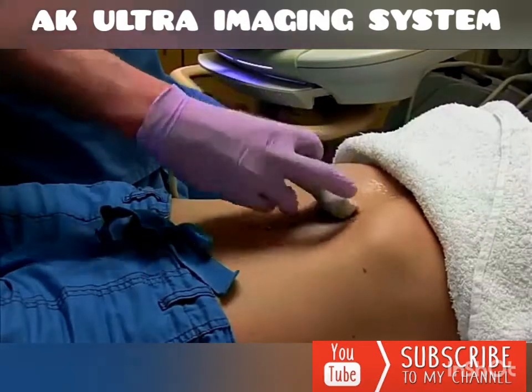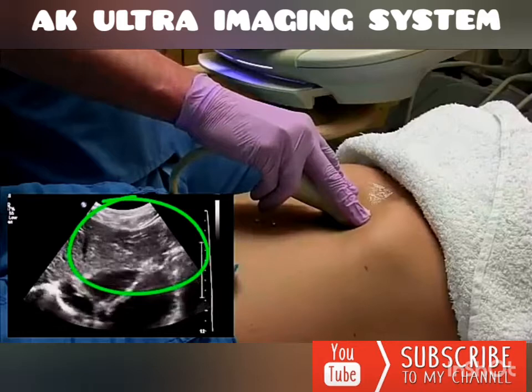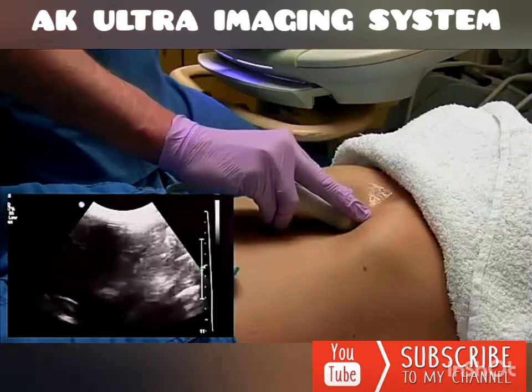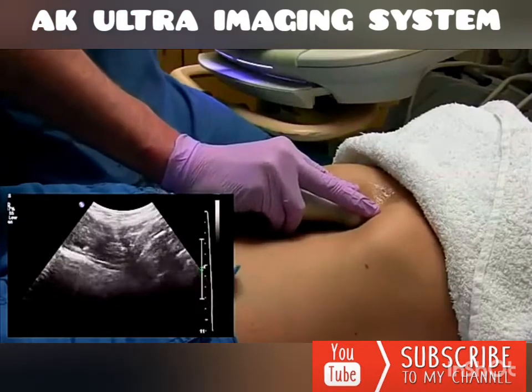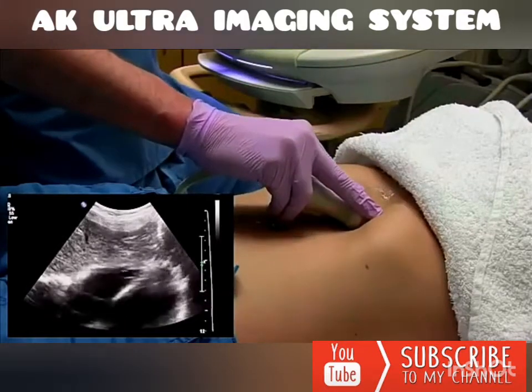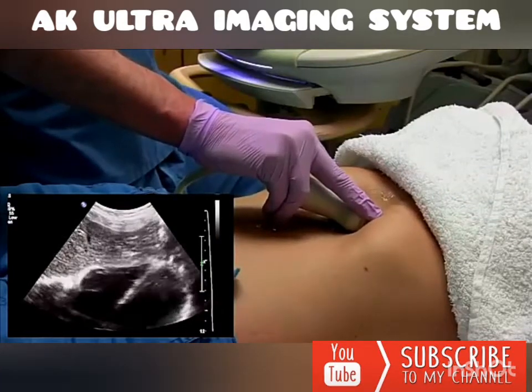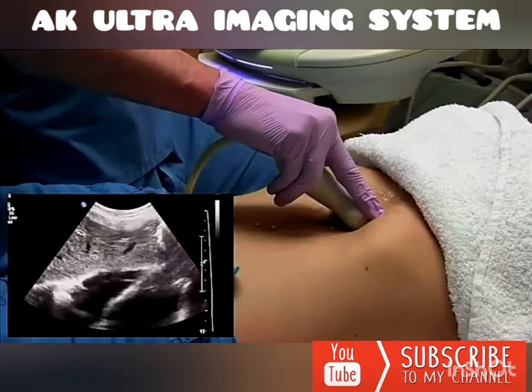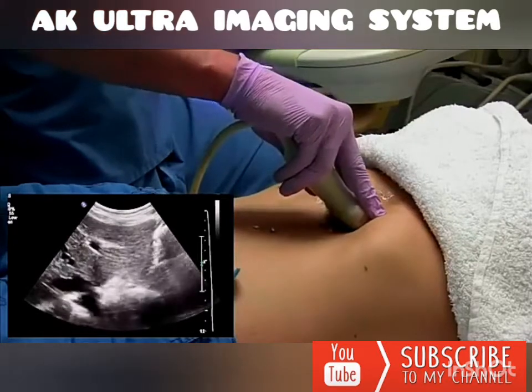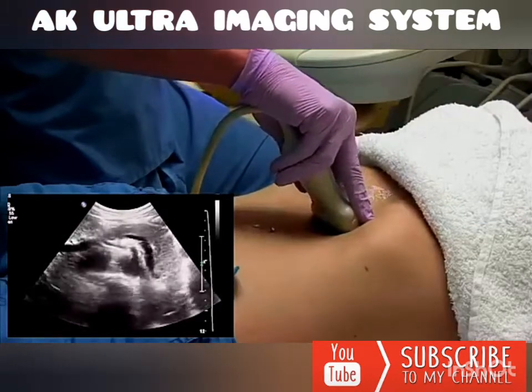Next we go transverse, and for that we're going to start again with the left lobe, subxiphoid. You grab the top of the probe here, and you want to make sure you sweep all the way up through the left lobe till you see the heart. And then as you come down, very similar protocol: you start at the top of the left lobe with the parenchyma. Coming down, you'll see the hepatic veins. And then last, you're going to see the portal veins. And you sweep all the way out of the left lobe here.